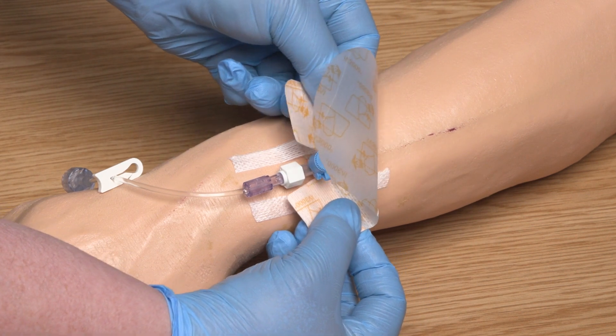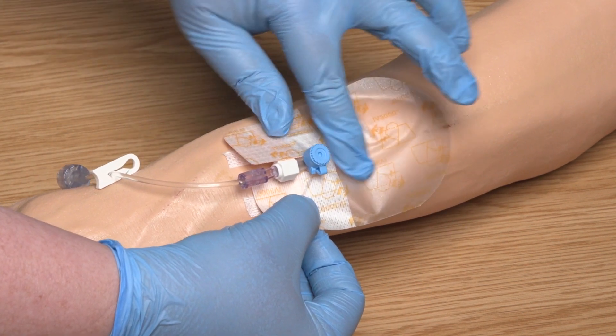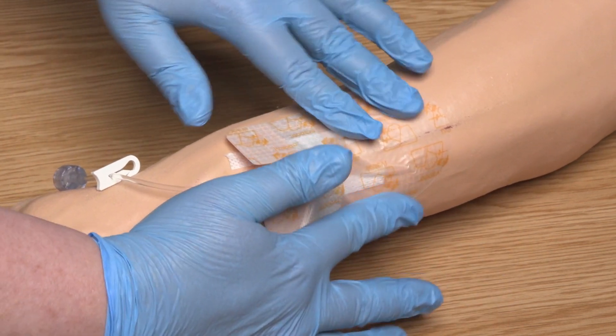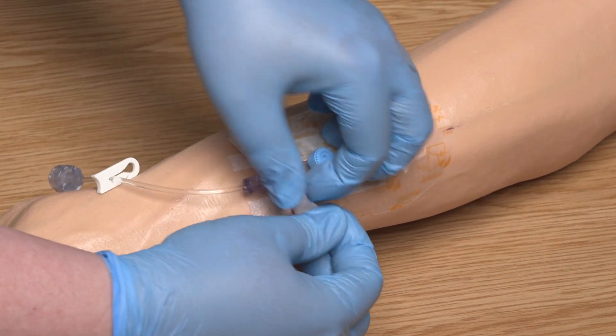The next step is to apply the dressing. This should fit closely around the hub of the cannula and should be flat against the skin with no creases, both of which prevent the cannula moving under the dressing and reduce the risk of infection.